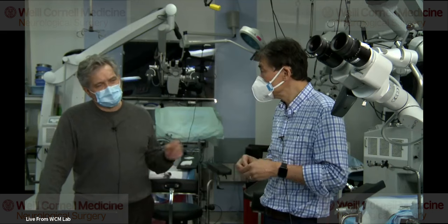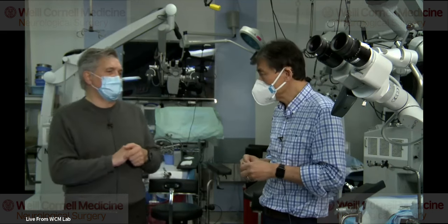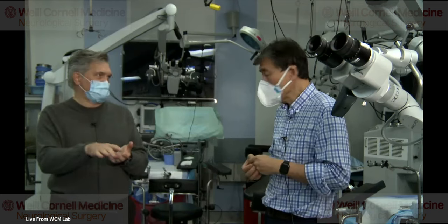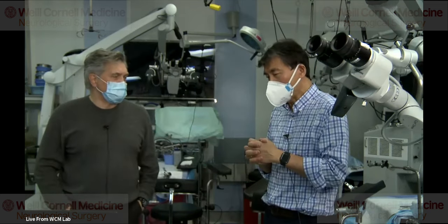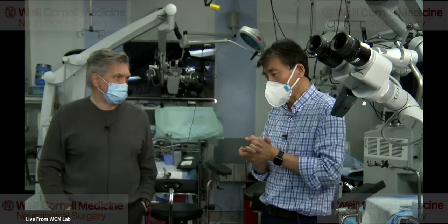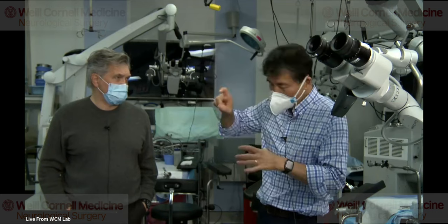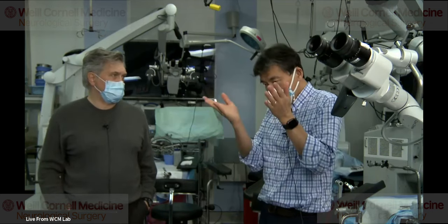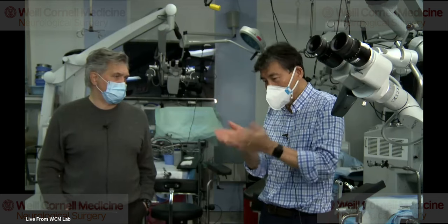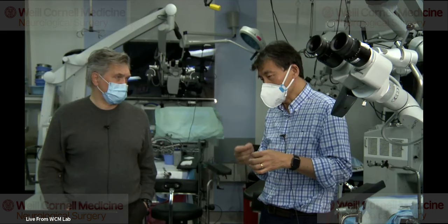So when you do the closure, you said you use 150 stitches. I assume you isolate layers of muscle and you individually close them. No, that's what the plastic surgeons do. I don't do that. What I do is I just take very tiny little bites. You don't want to grab a lot of the muscle because you necrose everything that's in your bite. So by coming down in the avascular muscular layer, you leave the fascia intact. So the first layer of closure is the interspinalis muscle.